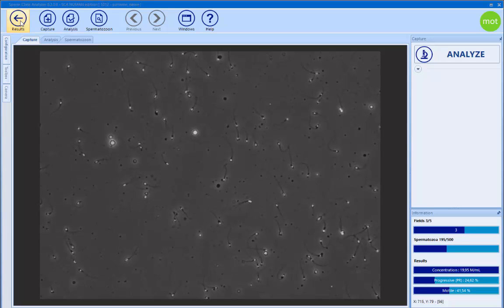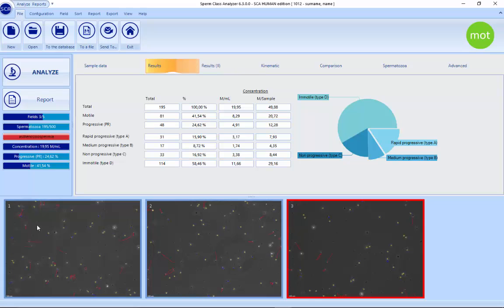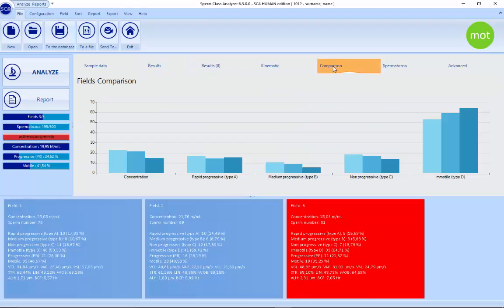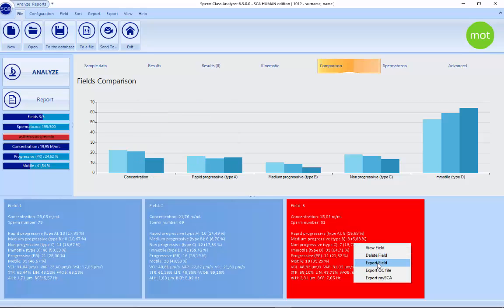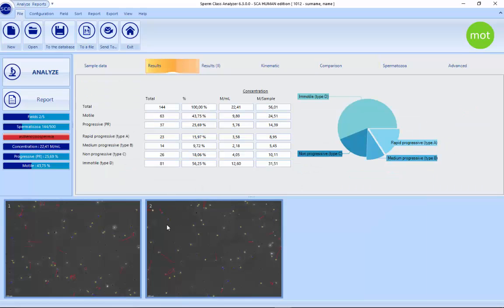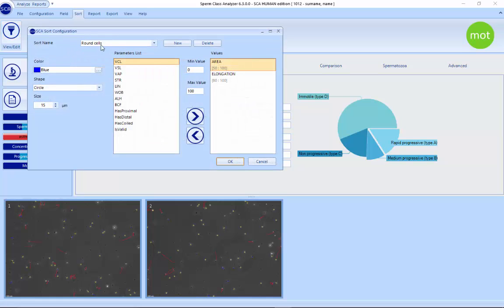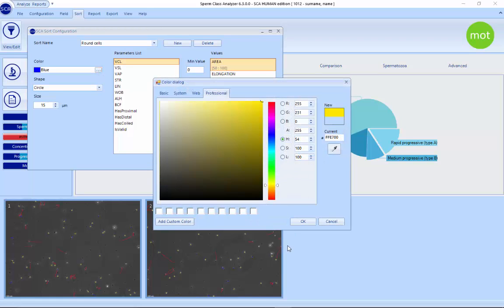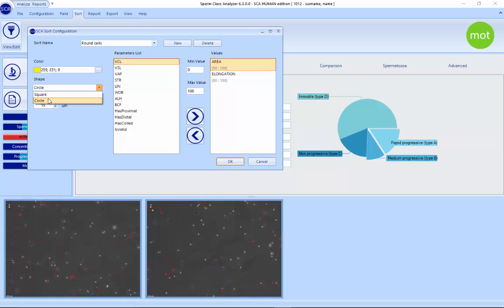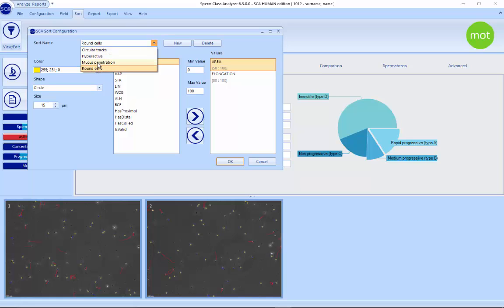Depending on the camera you have, you can capture up to 200 frames per second. Once we have the different fields, it's possible to check the comparison. If there is a red field, it means something is wrong with the concentration — we can see that this one is low. We can easily delete this field, and now everything is blue, meaning it's homogeneous. In version 6.3, in the sort settings, you can modify color and shape (square or circle) for each sort type, and add or delete sorts. For example: round cells, mucus penetration — a functional test automatically detected in fresh samples — and hyperactive, detected for capacitation samples.